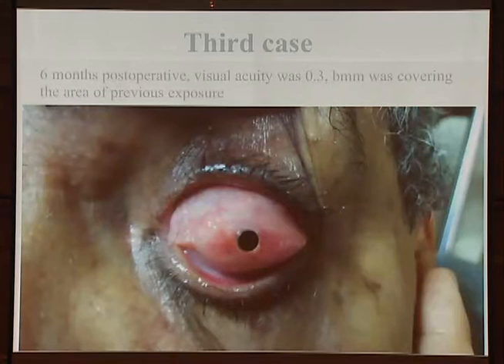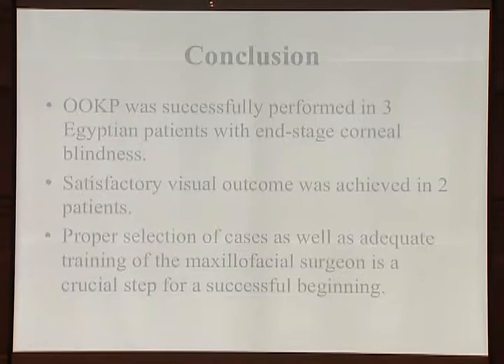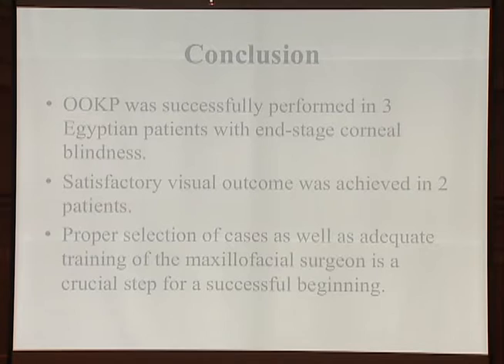Six months post-operative, visual acuity was 0.3, buccal mucous membrane was covering the area of previous exposure. So as a conclusion, OOKP was successfully performed in 3 Egyptian patients with end-stage corneal blindness. Satisfactory visual outcome was achieved in 2 patients. Proper selection of cases as well as adequate training of the maxillofacial surgeon is a crucial step for a successful beginning. Thank you.